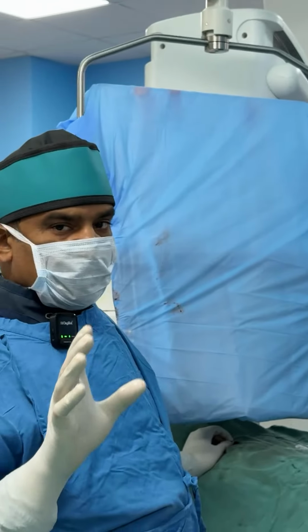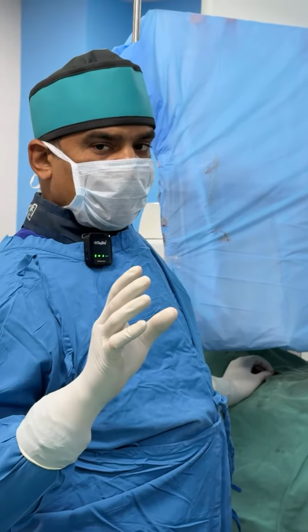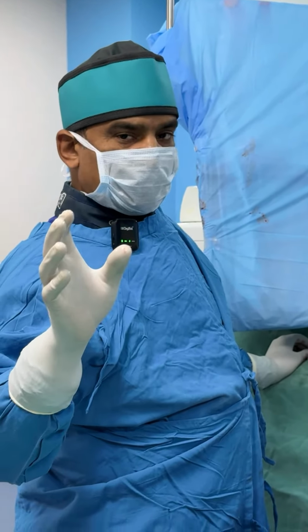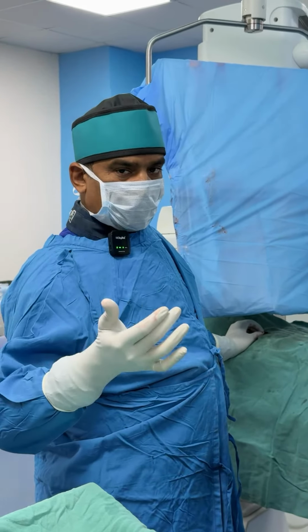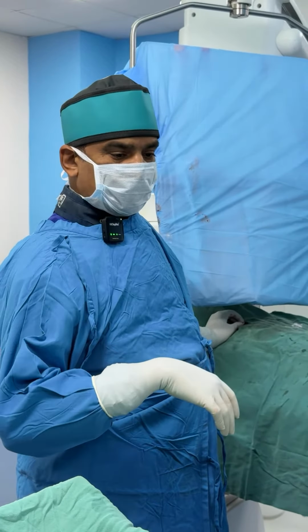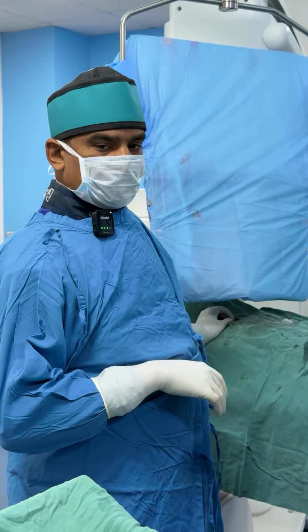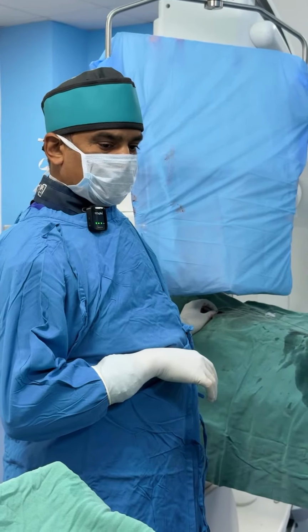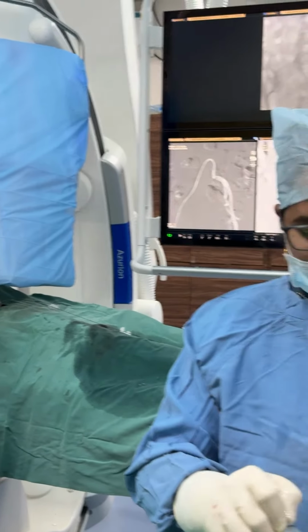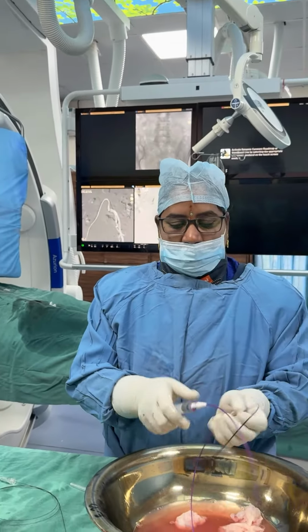So you can see that we went from the right side into the left side, common iliac, internal iliac, anterior division, uterine artery, occluded completely. Then we are coming back to the ipsilateral side, that's the right side, and let's try and get there. So it could be a little challenging.